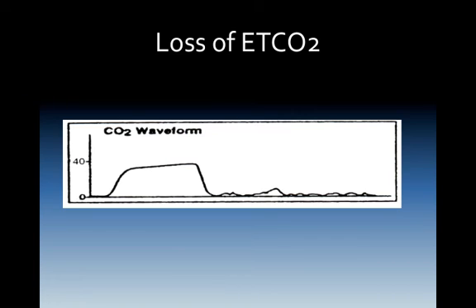Low levels really rapidly could mean total obstruction from a mucus plug. Mucus plugging that would be partial, if you started to see it stair-step down, which we'll talk about here in a little while, over time, they may have a partial mucus plugging that you can actually see. Capnography malfunction. Now, if there's vomit that entered into the side sampling, all of a sudden the machine cannot see the gas sample. So a lot of things can cause this.